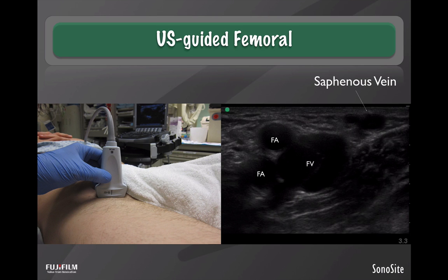And what's interesting about it is once you puncture the saphenous and slide your wire in, you hit the valve where the saphenous joins the femoral vein. And that's why those would never go in. You get flashback, couldn't thread the wire. Flashback, couldn't get the wire.